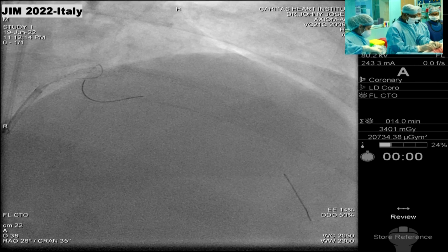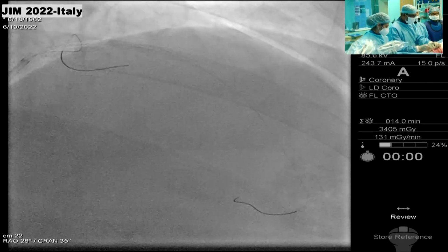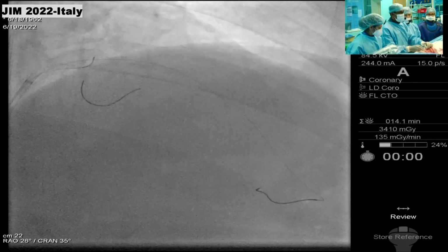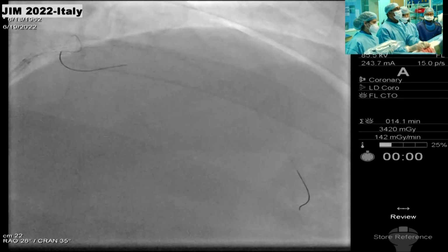I hope we have another 5 more minutes for the OCT to be completed, right? Yes, we have 5 minutes for the OCT, absolutely.